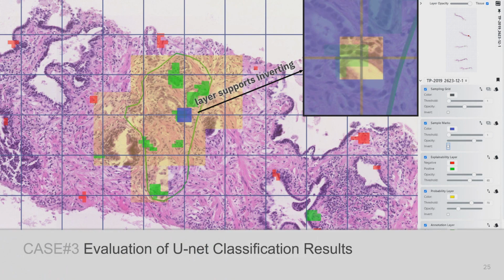In the third use case, the task was to evaluate whether the regions contributing to the classification of either cancerous or non-cancerous image patches can be classified to some previously estimated tissue patterns, and secondly, the relative frequency of such patterns in different cancer grades. Both tasks usually require error-prone and time-consuming pixel-level data exploration. Thanks to an additional sampling layer in a tailored visualization, the pathologist could quickly locate regions with unambiguous classifications and evaluate the whole image with reasonable effort in a reasonable time.